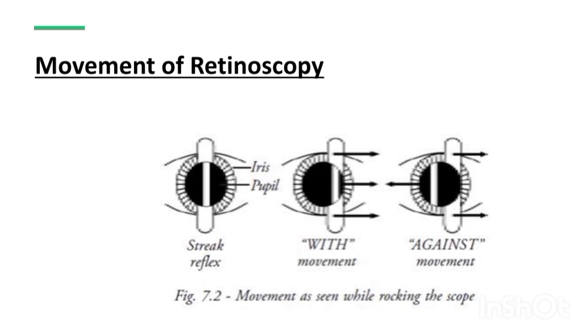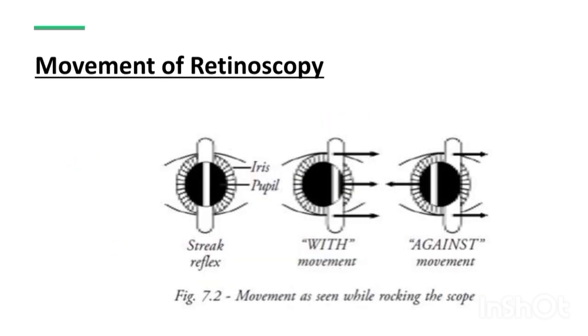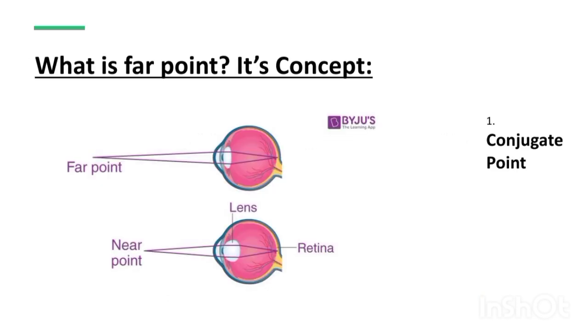Okay, actually this is something you will get to know when you practice. Okay, now we are moving on to the concept. So, what is the far point and its concept in retinoscopy?